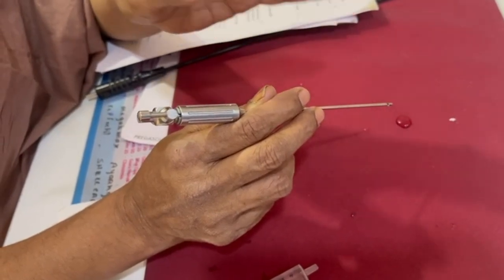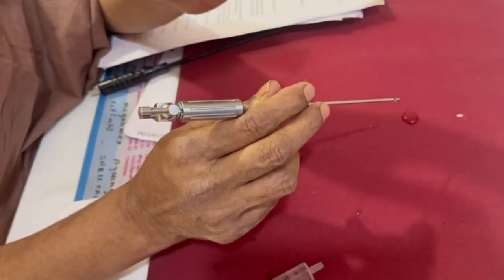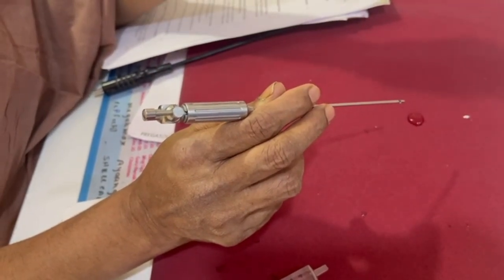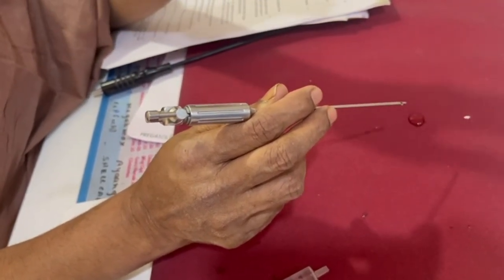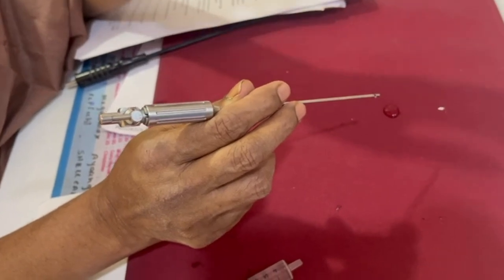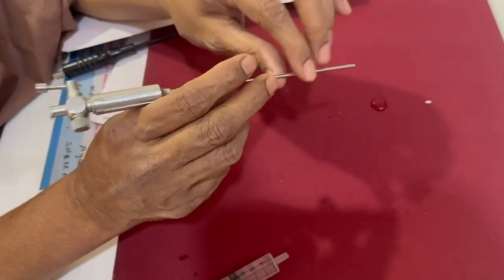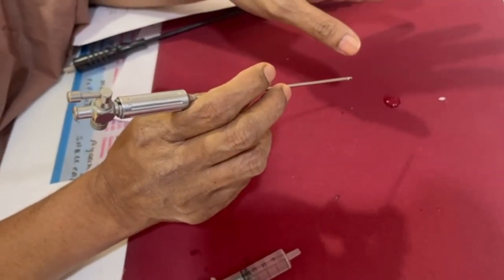The best test is the negative pressure or low pressure when the monitor is showing less pressure or negative pressure, less than 10 mm of mercury. That is the sure test which says that the needle has been placed successfully intraperitoneally.